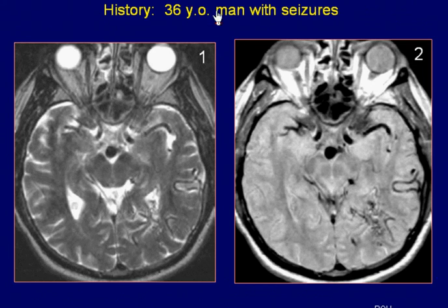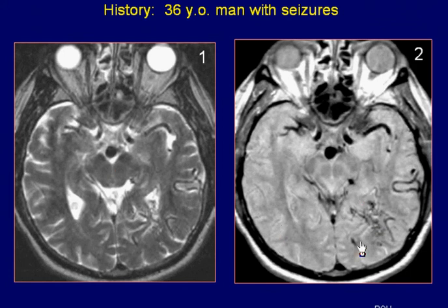A 36-year-old man with seizures. Axial T2 and proton density-weighted images of the brain reveal prominence of the distal basilar artery. A serpentine lesion is seen in the left parietal region.